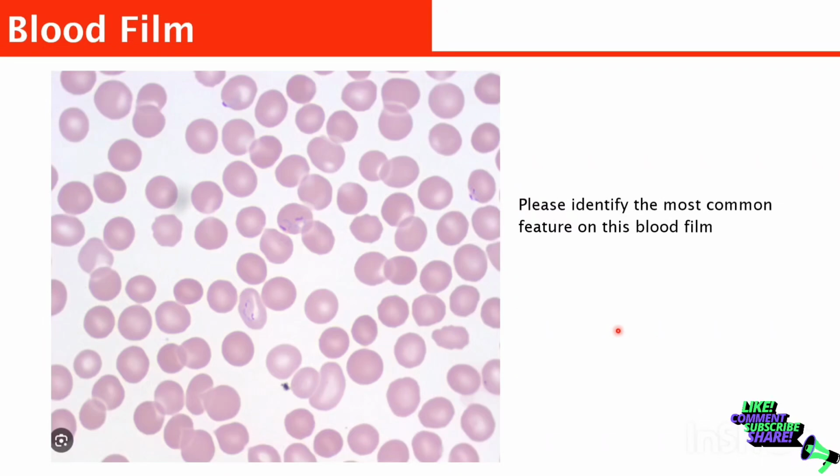Now, there are some of them that appear to be different shapes, but it is not significant enough from what I can see for us to call them poikilocyte or poikilocytosis. So I will stay under red blood cells, malaria parasite present, okay, and of course anisocytosis. That is fine. Now, if you look at this blood film morphology, there is something I'll say towards the end.